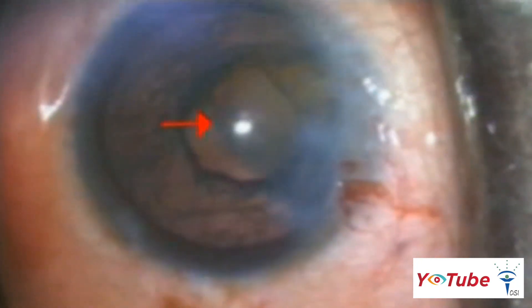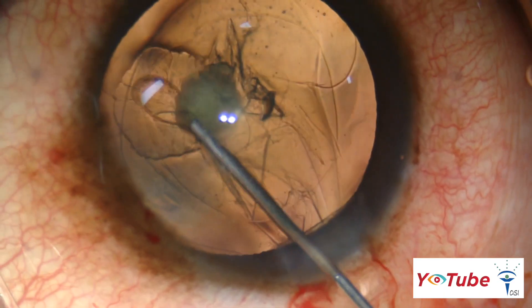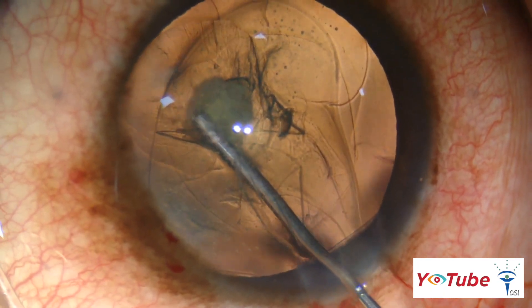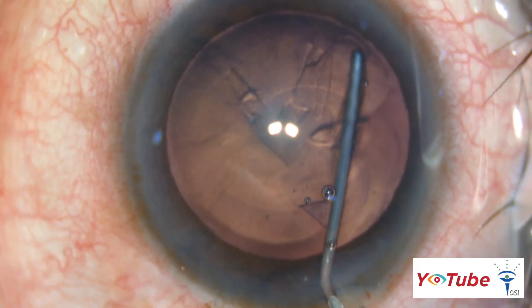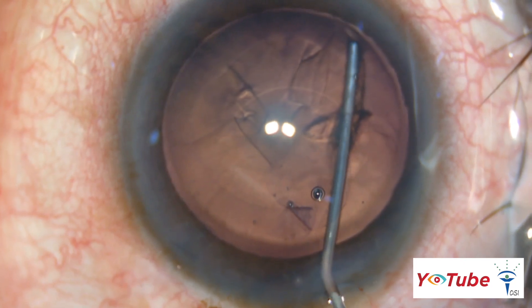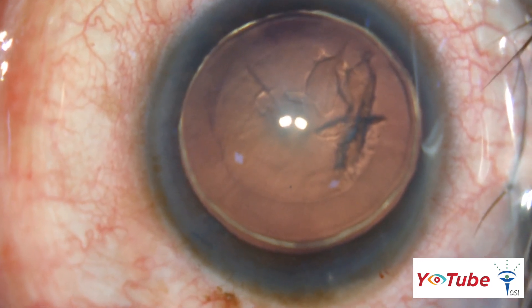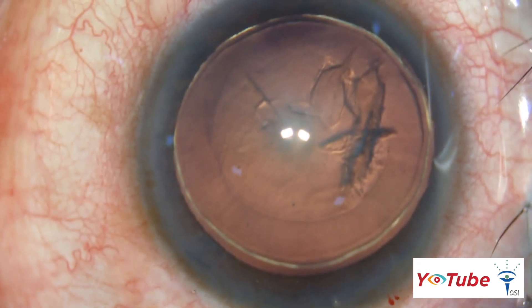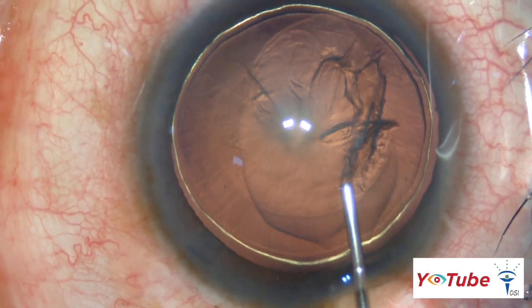Hydrodissection should be avoided as it may cause hydraulic rupture of the posterior capsule and a nucleus drop. Only hydrodelineation is done, creating a cushion of epinucleus and an endonucleus which is easily phacoemulsifiable. It is performed by depressing the tip of the hydrocannula into the substance of the lens, followed by multiple controlled injections of fluid to hydrodelineate the nucleus from the epinucleus. A characteristic golden ring is obtained.